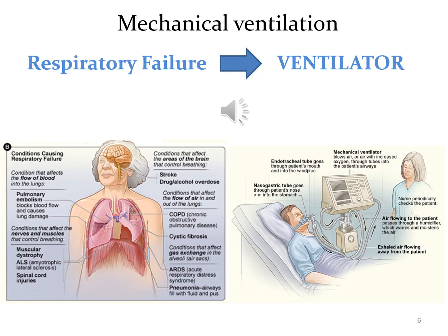To solve the problem of respiratory arrest or respiratory failure, mechanical ventilation has been proposed. It is used to improve the rate and depth of breathing during respiratory failure by generating and regulating the flow of gas into the lungs.